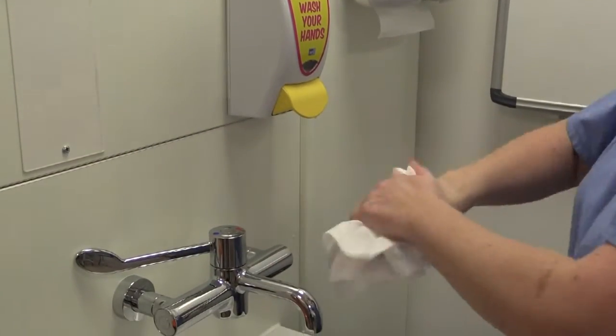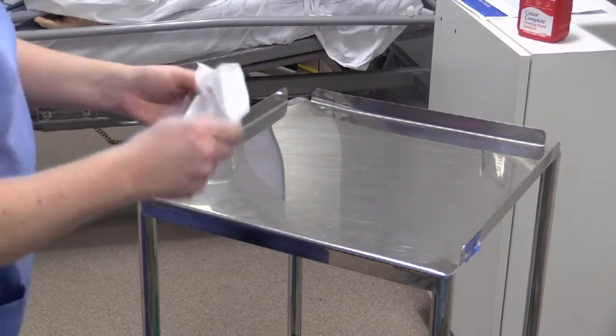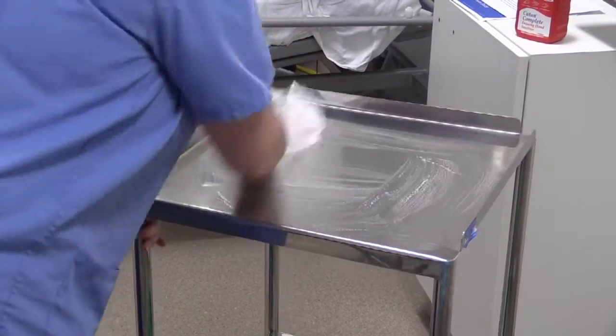Check whether they have any allergies. Maintain their privacy and dignity whilst achieving a comfortable position, with the use of a pillow if necessary. Check their ID bracelet or use three-point verbal ID.